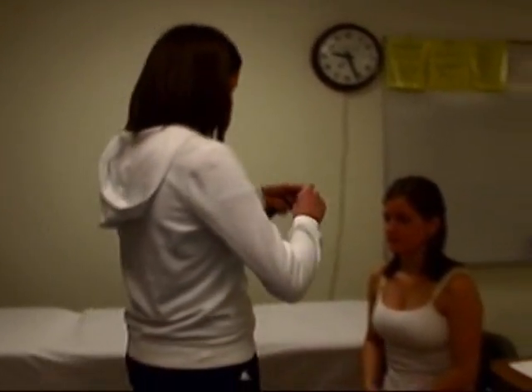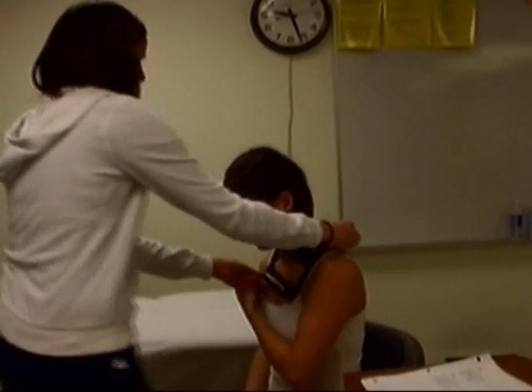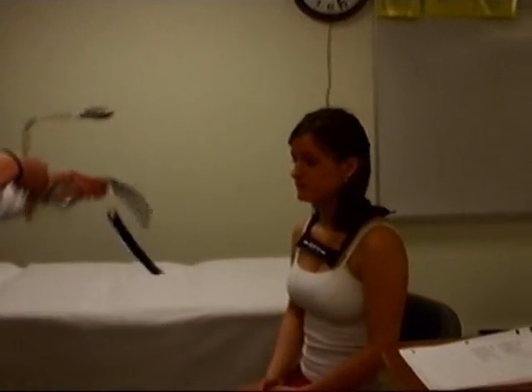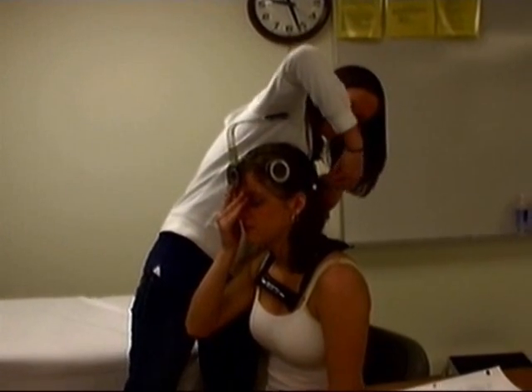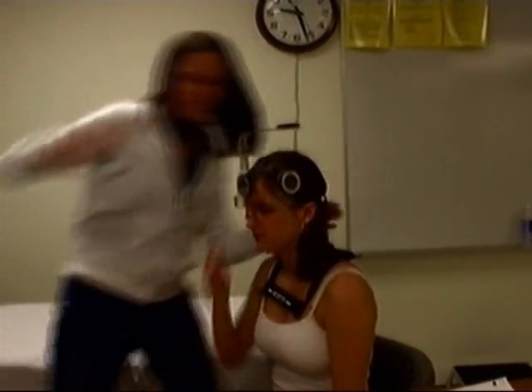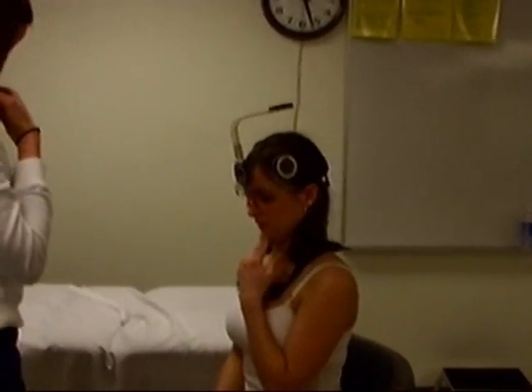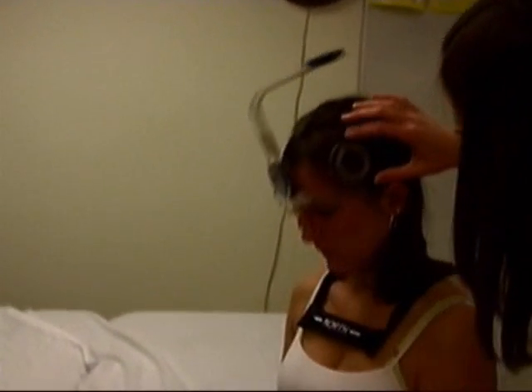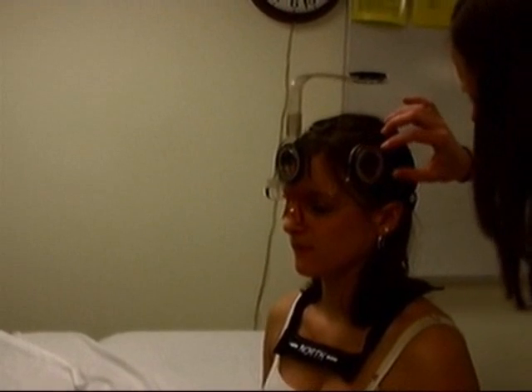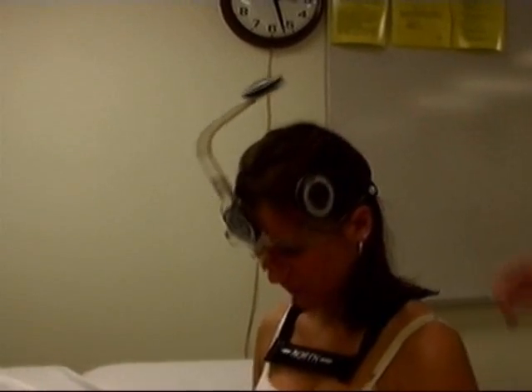I'm going to be sitting in the chair. We're going to start off doing cervical flexion with the goniometer, and then we're going to place this on your hand. What I want you to do is bring your chin, tuck it back, and bring it down to your chest. Bring it back up, and go down again. Normal range is 0 to 45, and you're at 0 to 47.